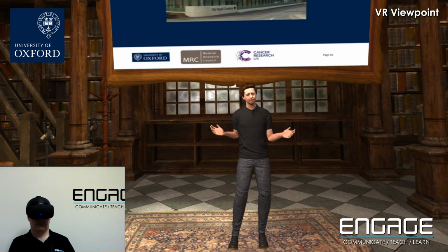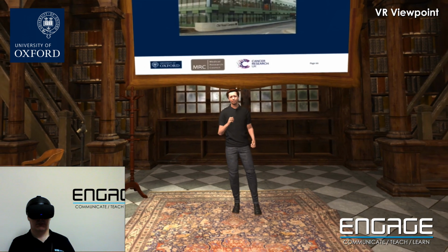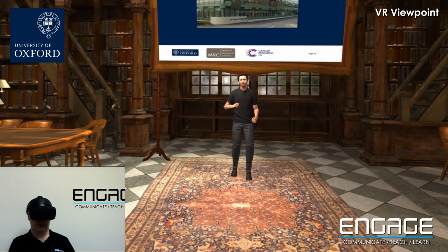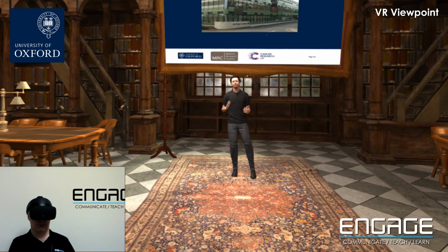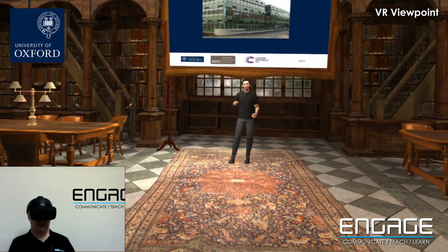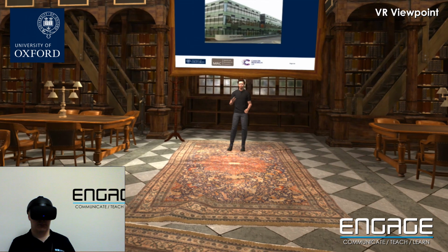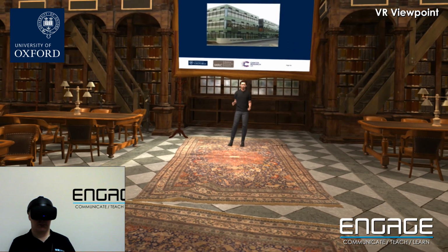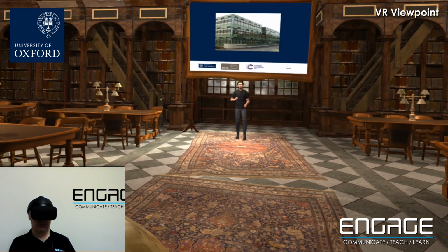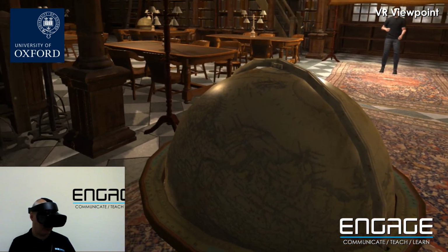So hopefully we've seen a little bit about how radiation physics works. We've seen how we are trying to package energy, drop energy into malignant cells, into tumor cells, into a tumor, and damage it. And we've seen that with X-ray photons, the challenge we face is that of crossing beams to catch the tumor in the crossfire, to shape the radiation dose around the tumor so that the tumor gets damaged and the patient doesn't. And that's been very successful, this multi-beam approach used in hospitals, and the side effects are very much lower than they would have been 20 years ago.